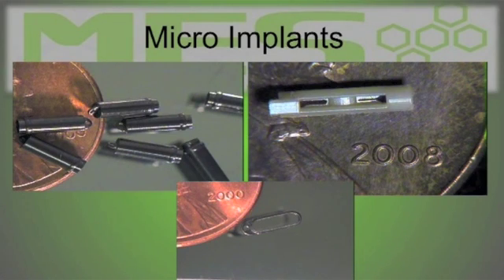Those other circular implants at the top and the cover on the bottom, the oval shape, those have PEEK wall thicknesses of 2 thousandths of an inch, which is a challenging thing to flow. This is actually a molded part, so that's a challenge to actually flow something that thin as well.